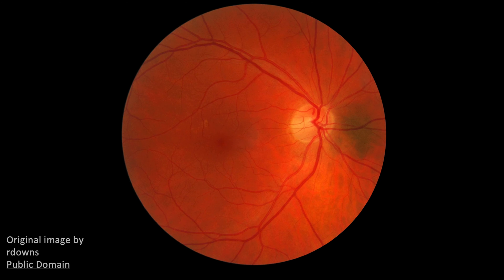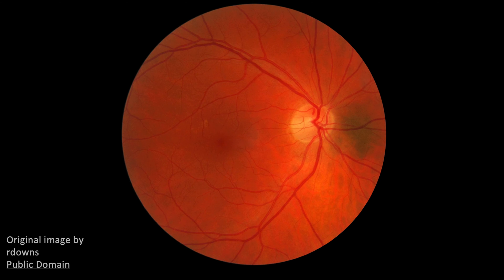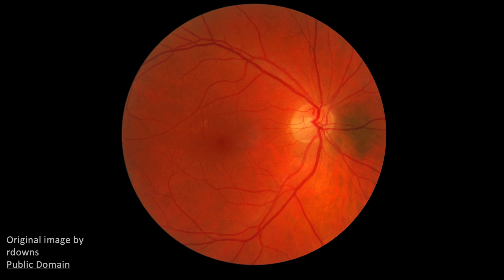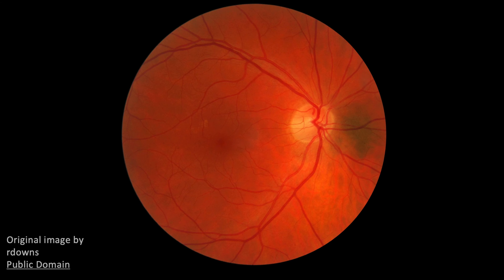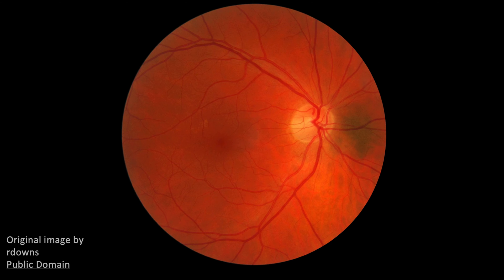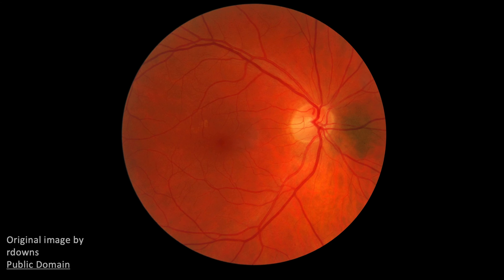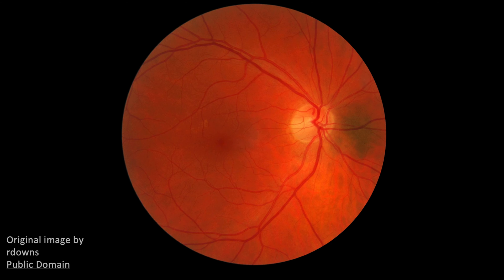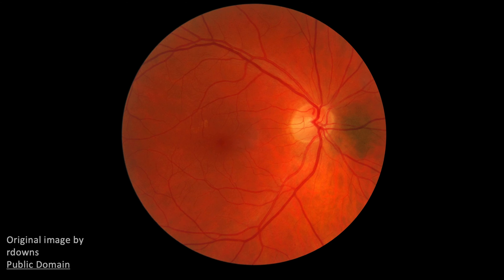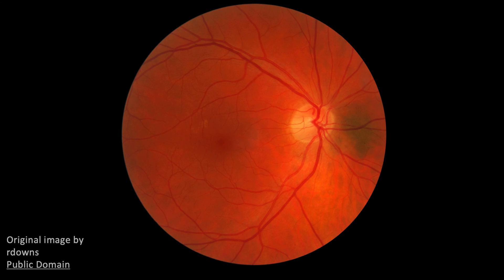Medial to the optic disc is a choroidal nevus. It is an ovoid lesion with a bluish-gray discoloration and indistinct borders. The remainder of the retina is normal. Choroidal nevi may slowly enlarge until the end of puberty; however, any changes that occur during adulthood should be regarded with suspicion.